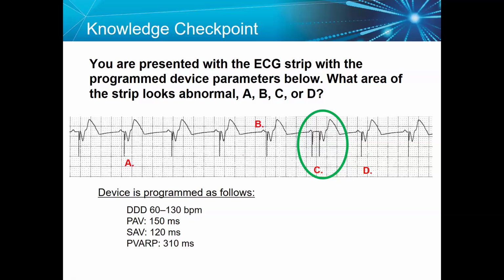Okay, atrial undersensing. Yes, we see the P wave and it is not sensed. Then after that, a spike, atrial pacing, occurred and did not capture because it paced in the absolute refractory period of the atrium.